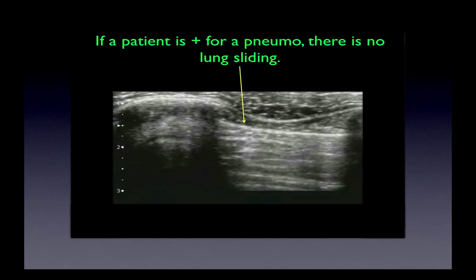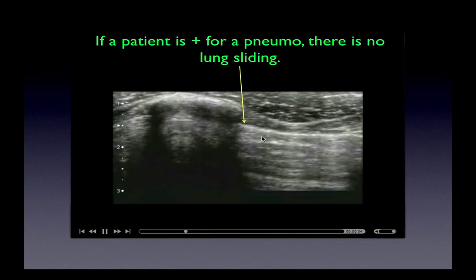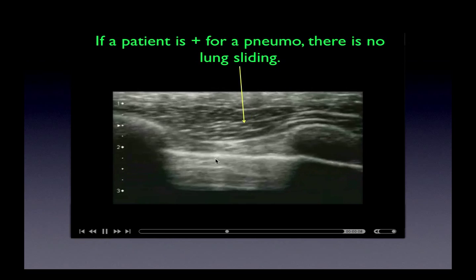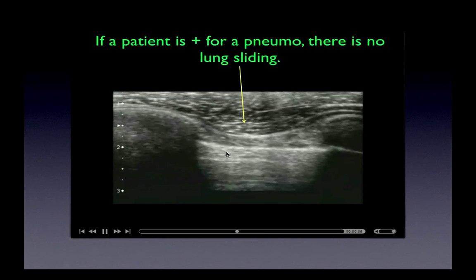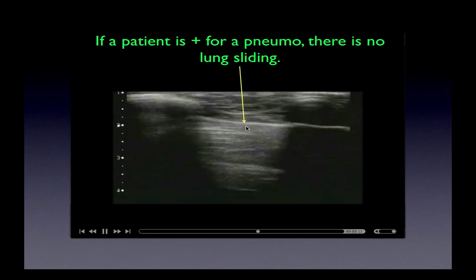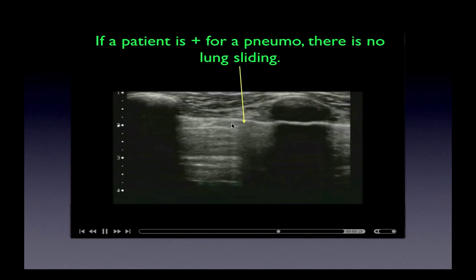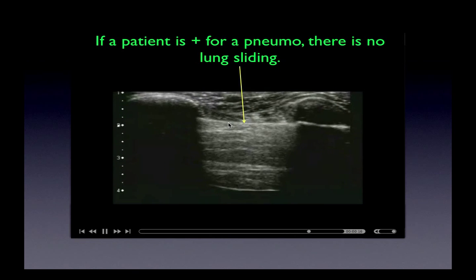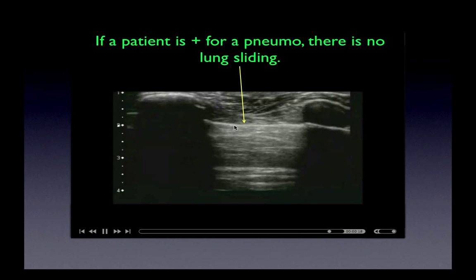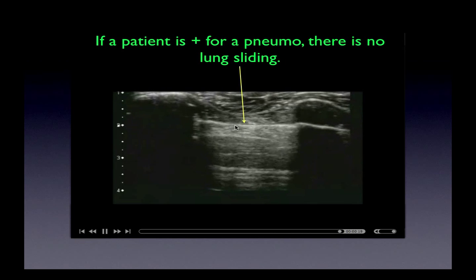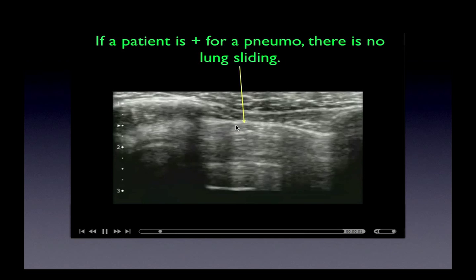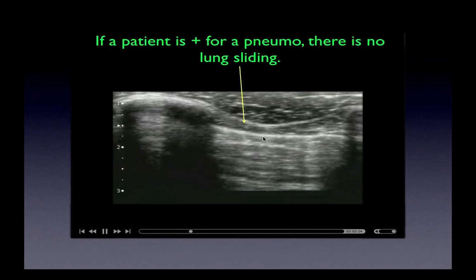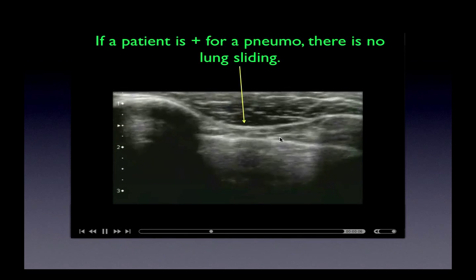Now, if a patient has a pneumothorax and we look at this line, there's no movement whatsoever. Again over here, no movement of this line whatsoever. This is a classic visceral-parietal interface appearance for a pneumothorax — same here, no movement.